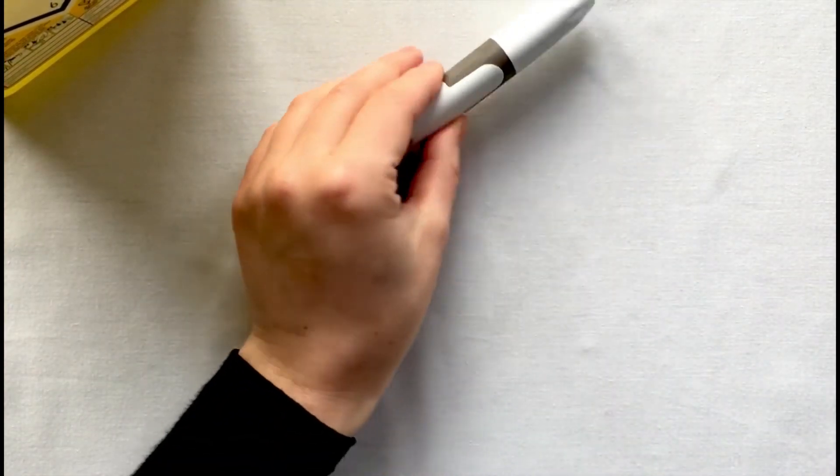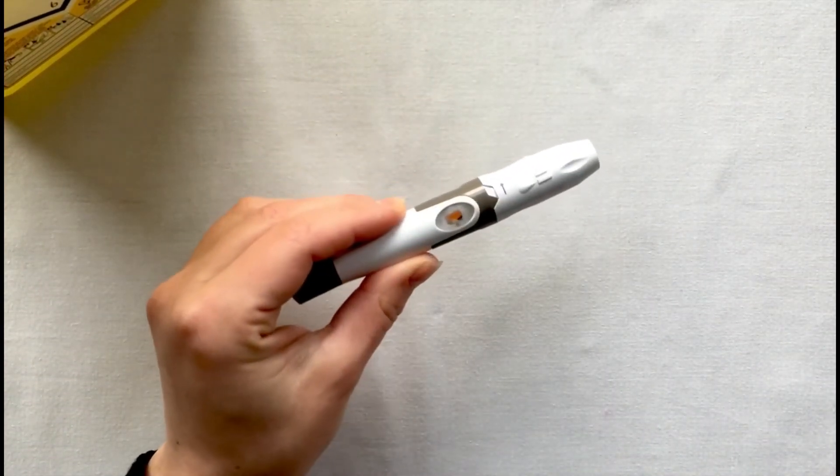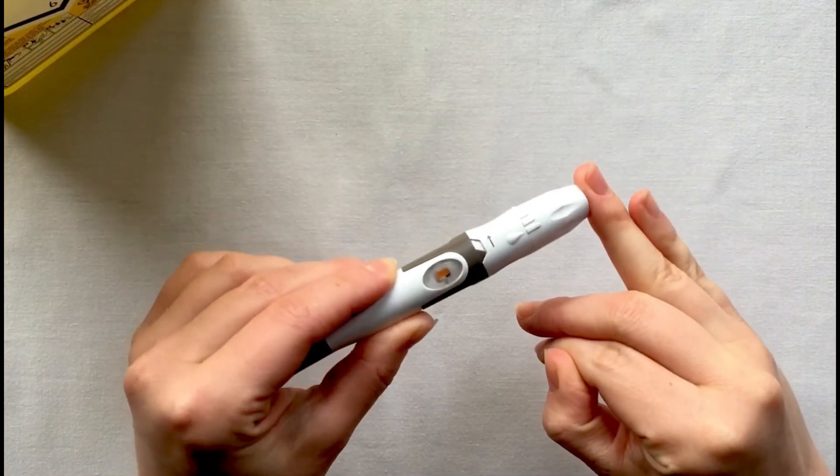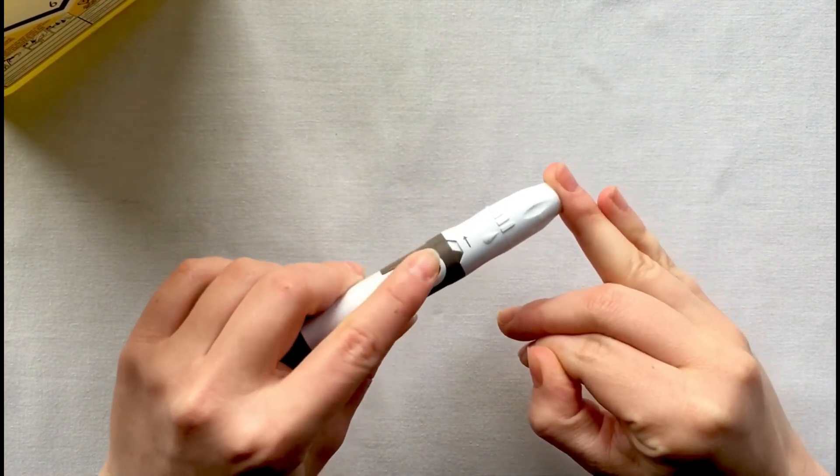Take your preset lancing device and hold the lancing device firmly against your puncture site. Apply pressure to the orange trigger button on the device.